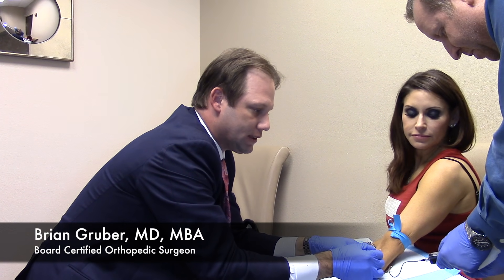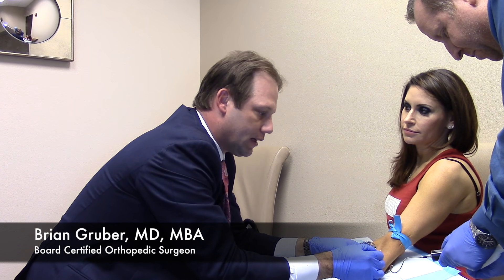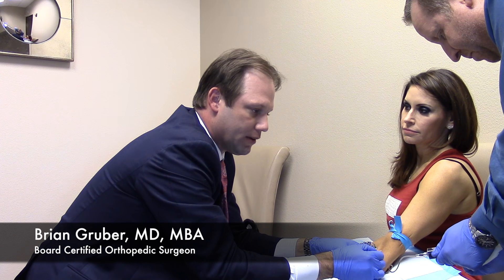So what we do now is we draw about 20 cc's of venous blood — this is in the vein, not in the artery — and it typically is a relatively painless component of the procedure.